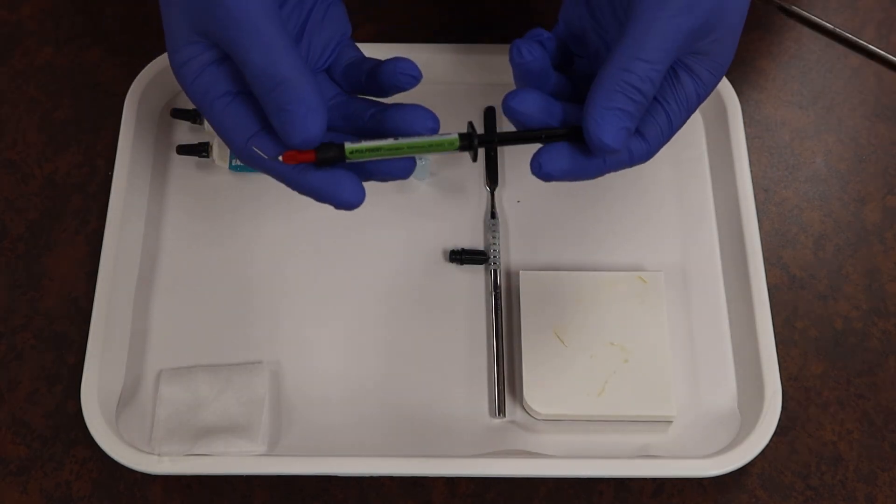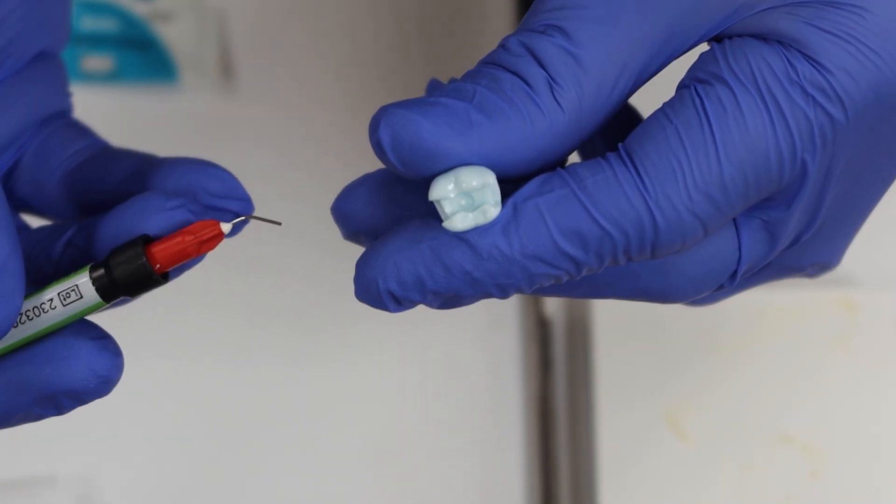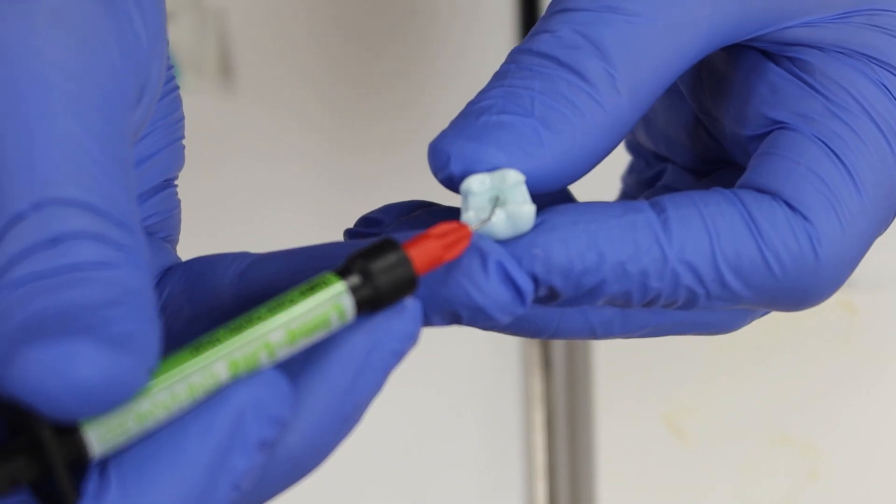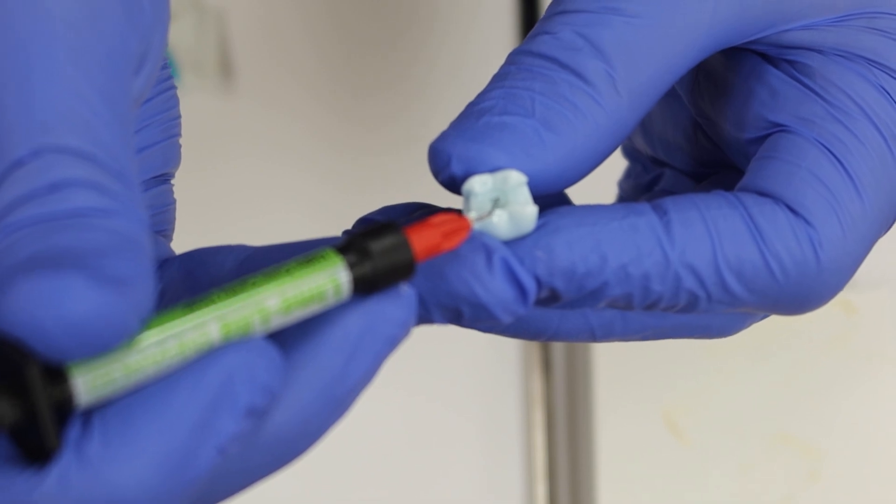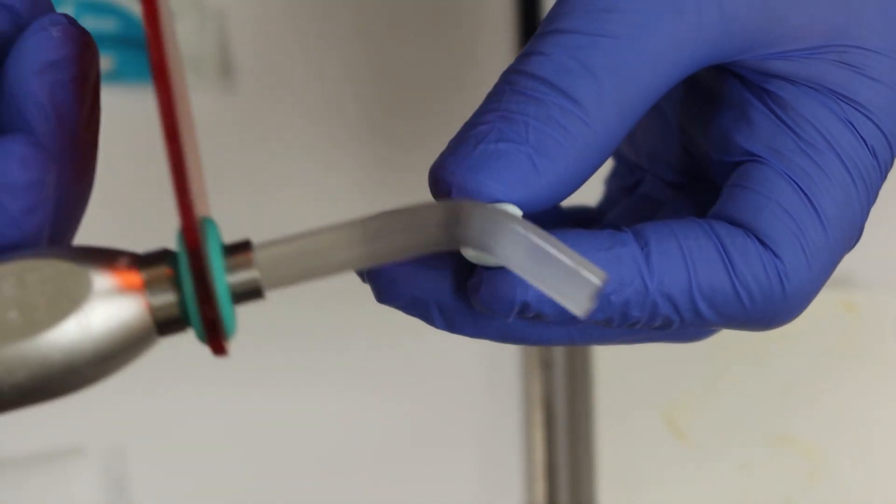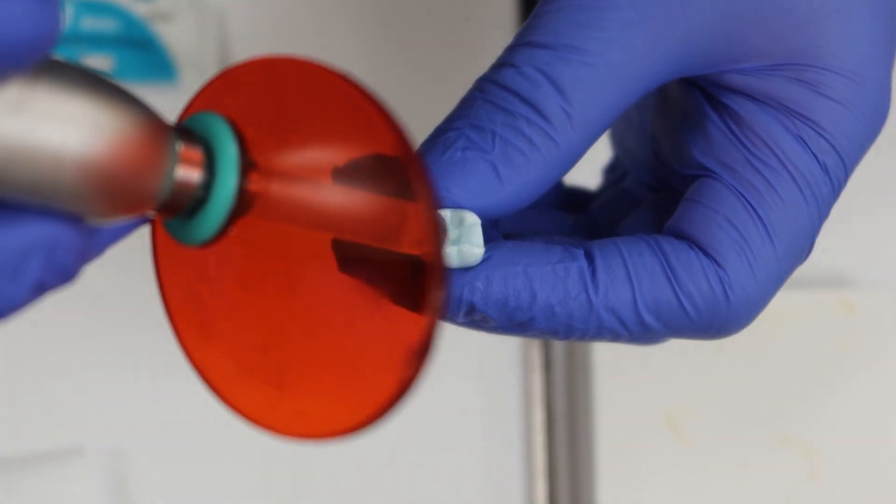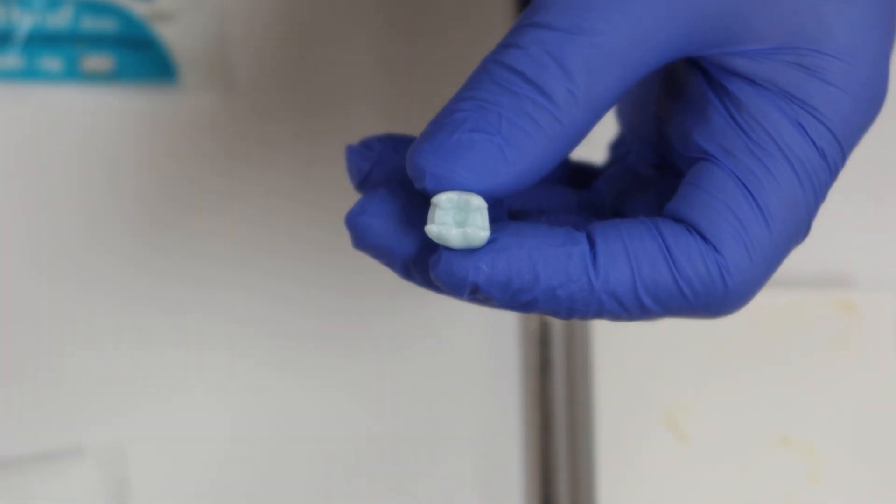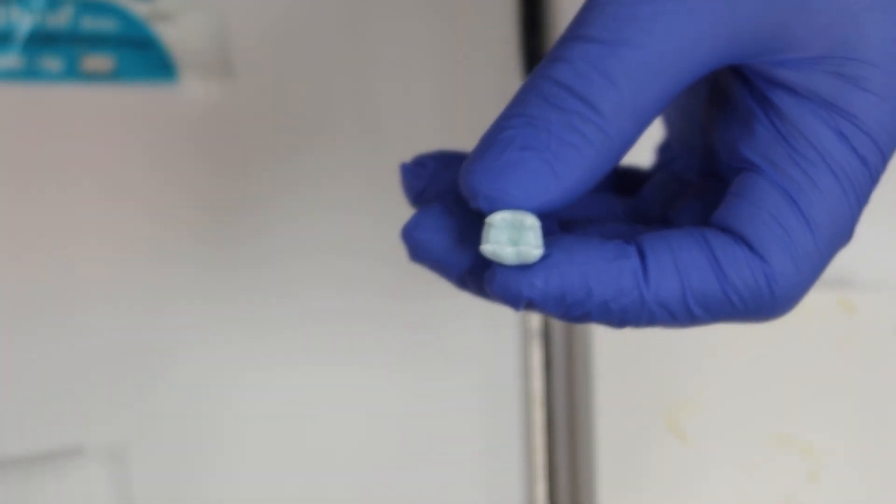Another material we have access to is Limelight. From there, we can just take it in its syringe, place a small dot at the bottom on the floor like we did before, and then we go over and inspect. And from there, go ahead and take in the easy decision of getting our light cure and hitting it with our light cure so that it's fully cured and hard to go to the next portion. No waiting involved or extra materials that are needed.